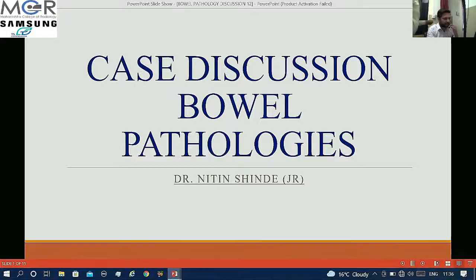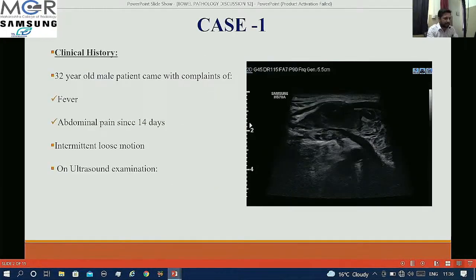Good afternoon, we are discussing some cases. This is case number 1. A 32-year-old male patient came with complaints of fever and abdominal pain since 14 days. He was also having intermittent loose motions.